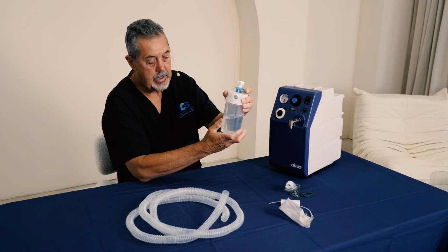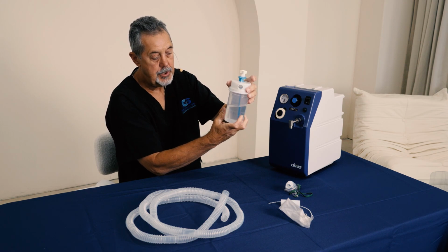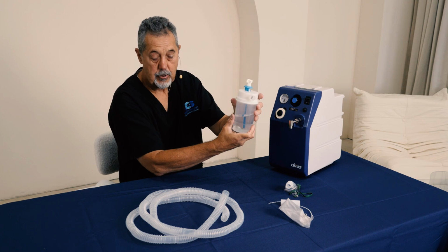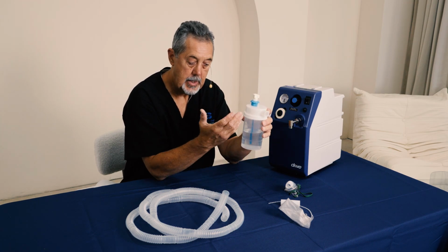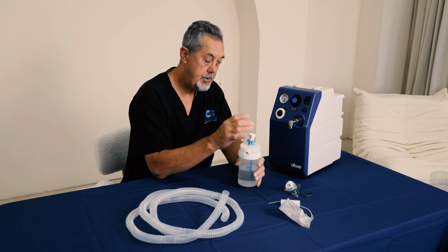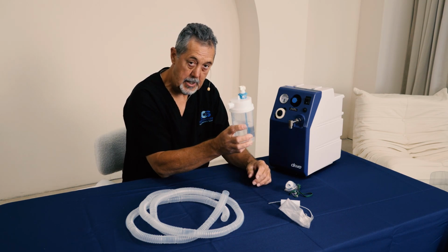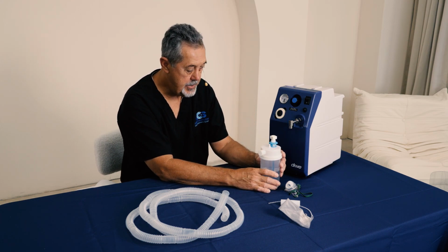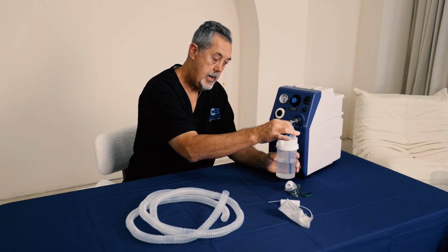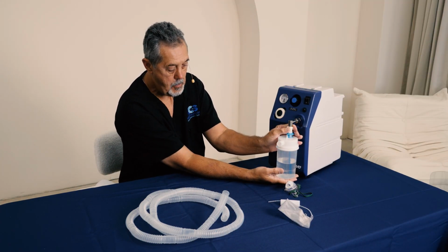When you're putting this together, you want to make sure that you have the bottom screwed into the top nice and flush. You don't want to cross thread it, because if you do, it's not going to work for you. It's the same thing when you're screwing it onto the 50 psi compressor. You have to be really careful not to cross thread these, and these are not easy to get on there, believe it or not. So you present it, and then make sure that it's nice and snug. You want it snug here and snug here.